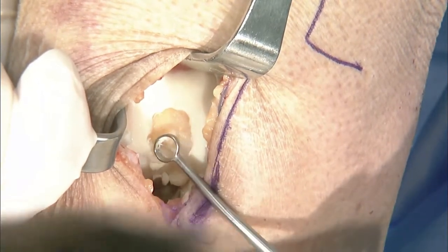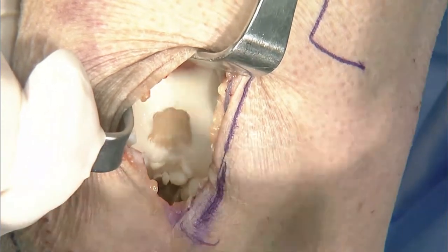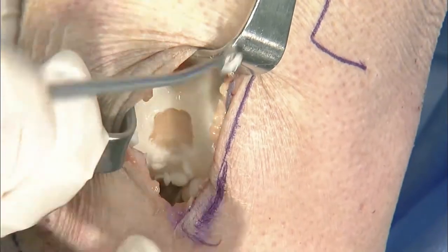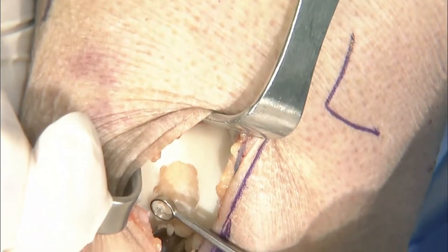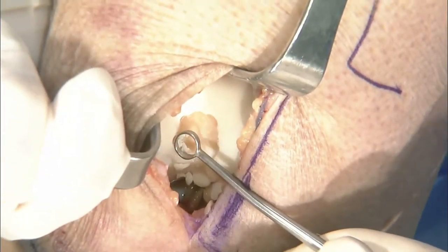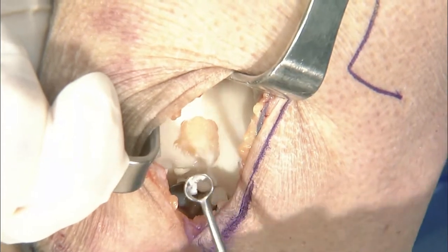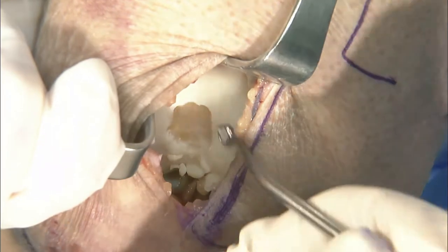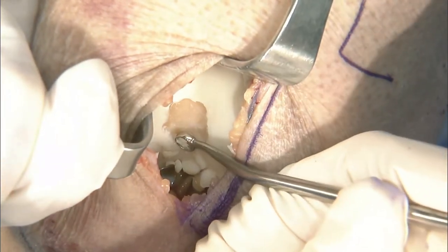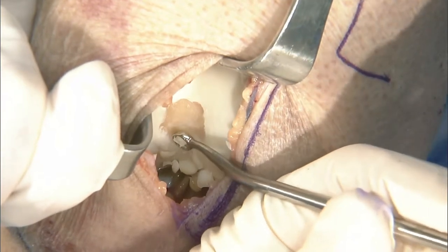Yeah, so the intralesional osteophyte thing is a little bit of a touchy one because I think that some people may consider a different technology altogether. And I think it just depends why the osteophyte's there, how big it is, what's the true status of the bone, and do you feel comfortable leaving it or not. And then obviously sometimes you encounter one that you didn't expect and is smaller. And I feel the exact same as you. Usually you can use a curette. If you get to a smaller curette, again, it's usually easier to get rid of than if you stick with the bigger ones. And I don't really use a burr or haven't had to with any frequency.